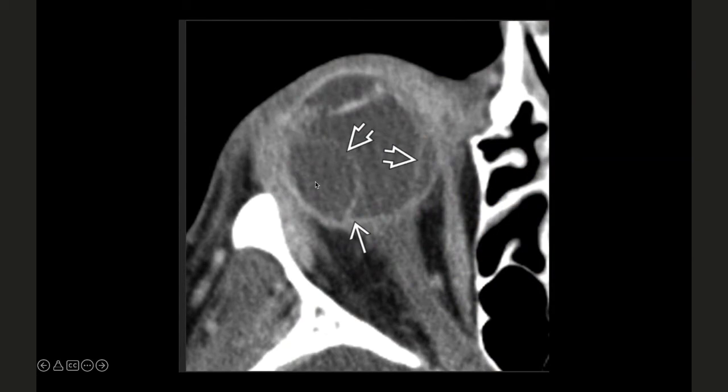So I'm going to stick to my turf, which would be telling, hey, I'm seeing this exudate, I'm seeing choroidal detachment. And sometimes when I don't say something, it means not that it is not there, but sometimes I may not be able to see it. We already said how we are not good at looking at iris and ciliary body sometimes, right? Anyway, so again, you see the same choroidal detachment, but this time this one is not enhancing as much. It's just an effusion right there.